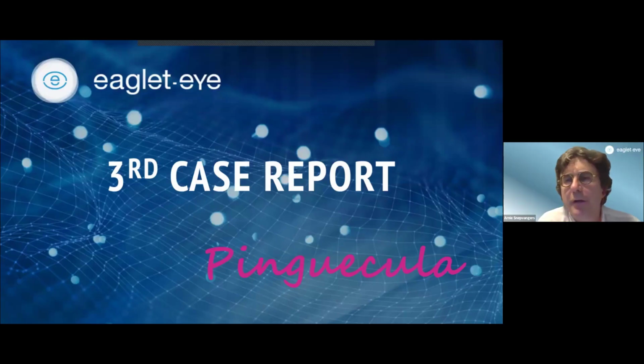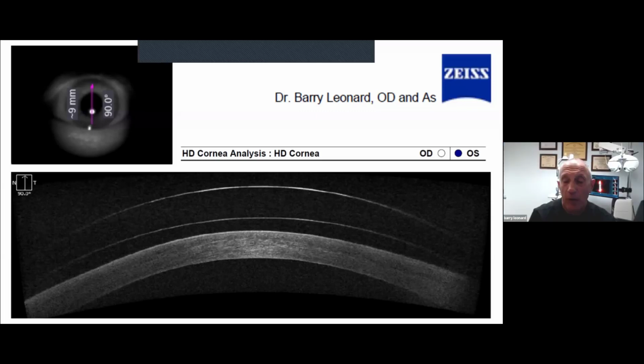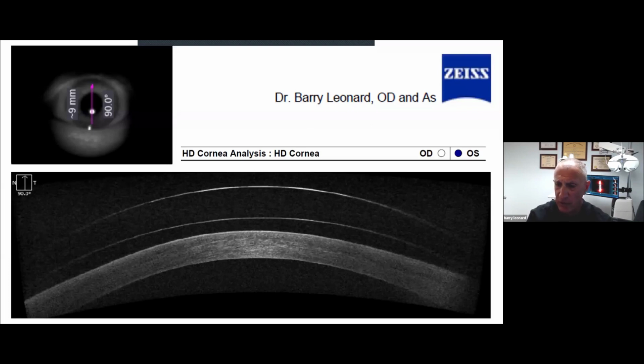Yeah, can you kind of from a gut feel, could you say, with such toricity, without profilometry, how many refits would that have been? Oh, probably 10. I mean, I would have started off because even the kits back in those days didn't have that much to start with. They're spherical. So maybe I'd order 100 this way and 100 that way, a couple hundred, and add another 100, maybe add another 100 or 50. How much would you even add each time? Because we just move along real slow.